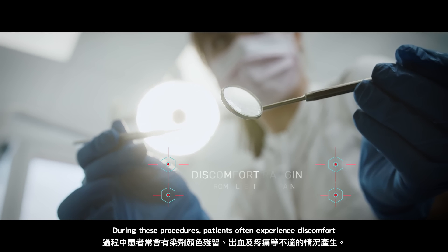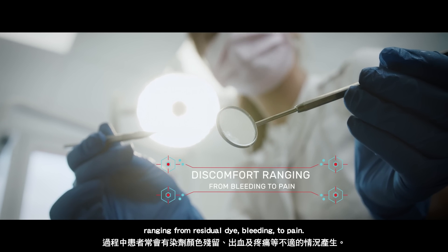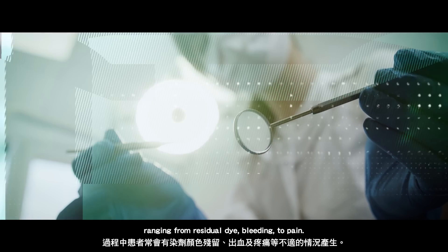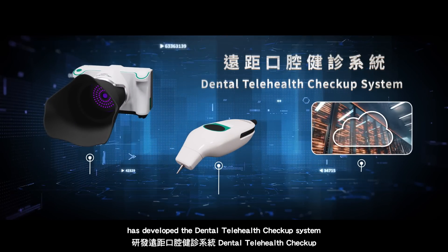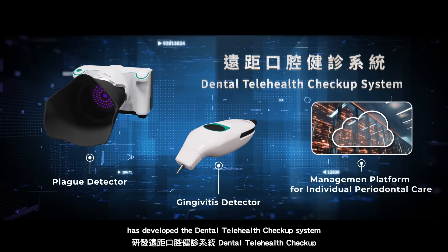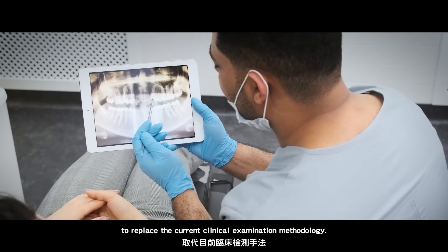During these procedures, patients often experience discomfort ranging from residual dye, bleeding, to pain. The Metal Industries Research and Development Centre has developed the Dental Telehealth Checkup System to replace the current clinical examination methodology.